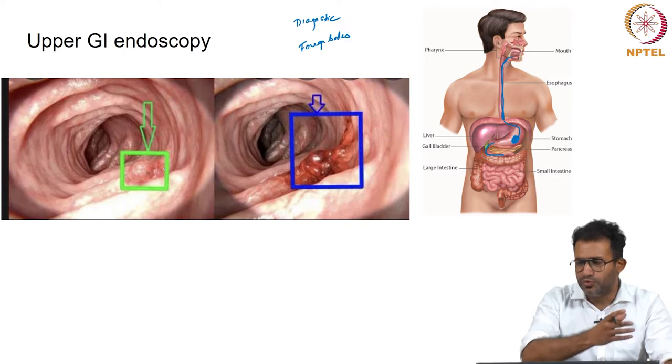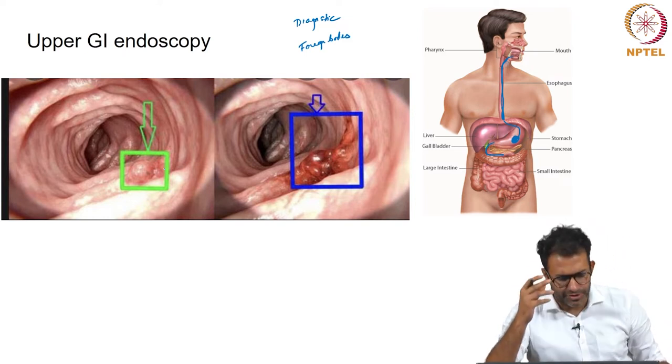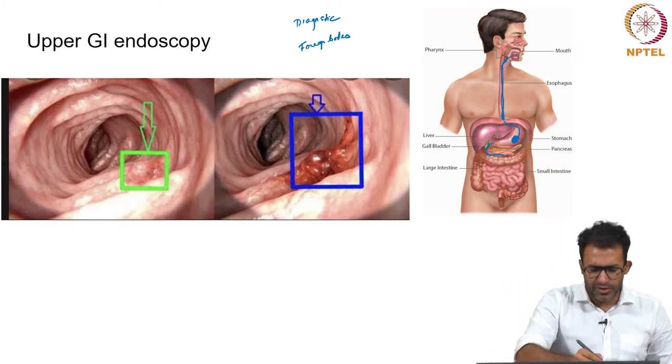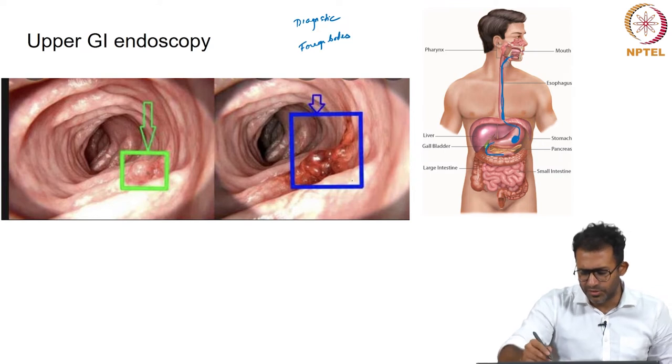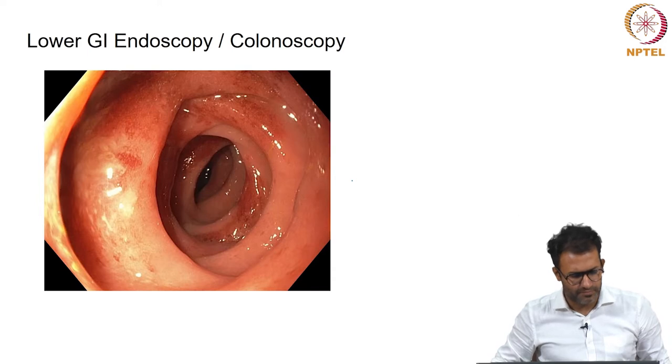Endoscopy, because of the huge volumes, has immense applications in the area of machine learning and supervised and unsupervised learning as well. Here you can see somebody has boxed the lesion in both these images, and you can use machine learning tools to understand what these are.